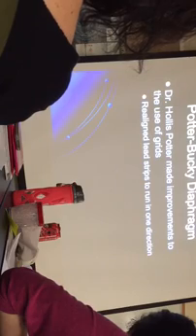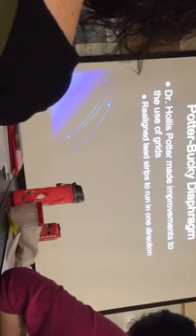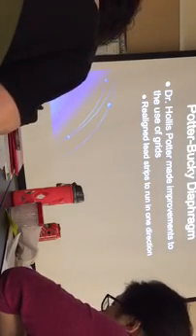The advantage of a grid like this is that when you have a crosshatch grid, you have to be perfectly centered at the perfect distance, and one slight angle on your tube, in this direction or this direction, and you're going to get lost. With a crosshatch grid, you're going to have grid cutoff. What is grid cutoff? You're going to have an area that has more density than another area.